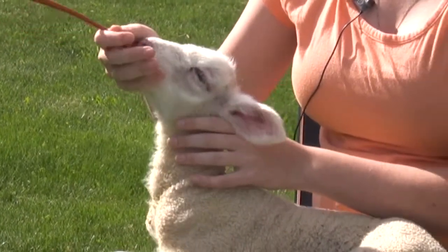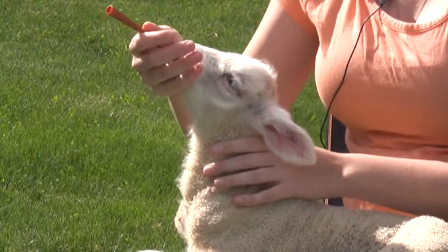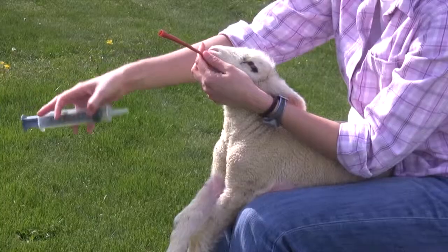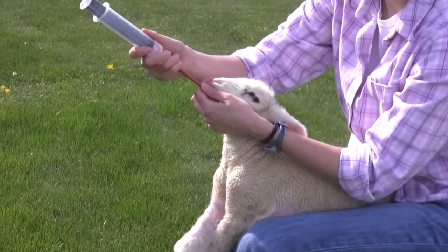If the lamb begins coughing, gagging, or acting violently, it means you have inserted the tube into the trachea and not the esophagus. Do not begin feeding if this happens. There are several ways to check that you have properly placed the stomach tube.